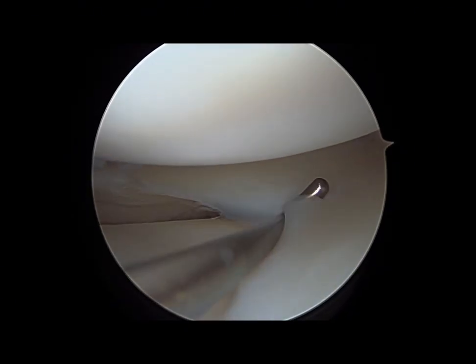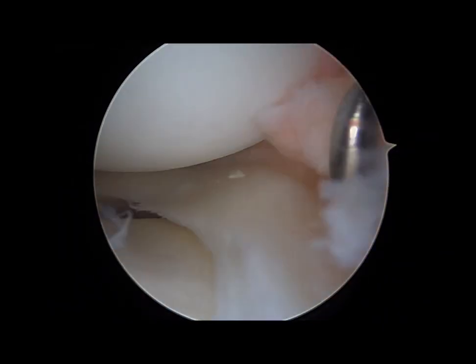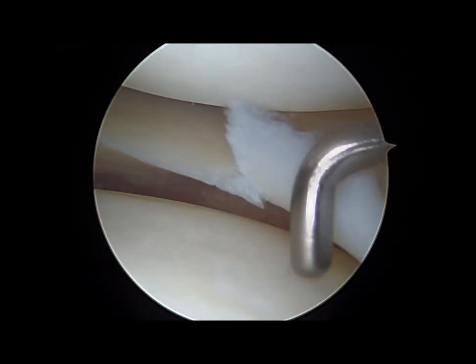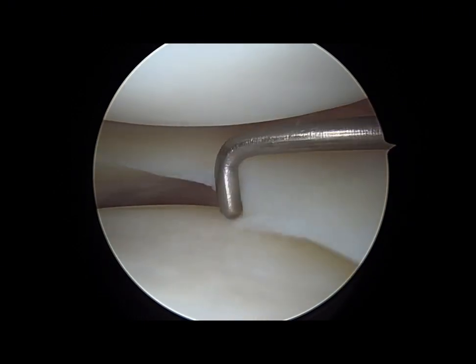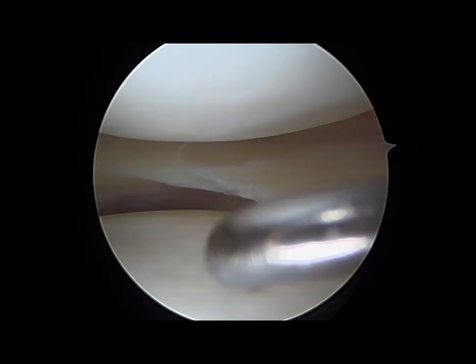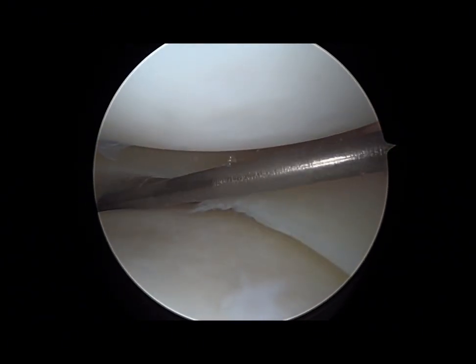In this case, we had a concomitant oblique tear in the posterior root of the lateral meniscus. To encompass the whole meniscus in a single visualization through the arthroscope, we recommend switching portals to better visualize the posterior lateral meniscal root from the anteromedial portal. This can be done while varying knee flexion to better optimize visibility.